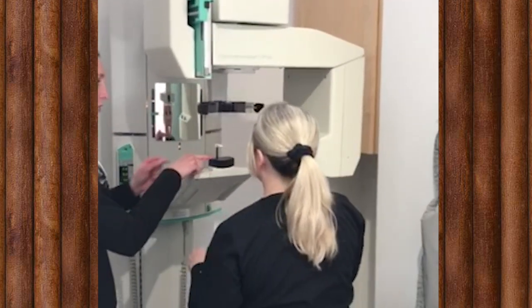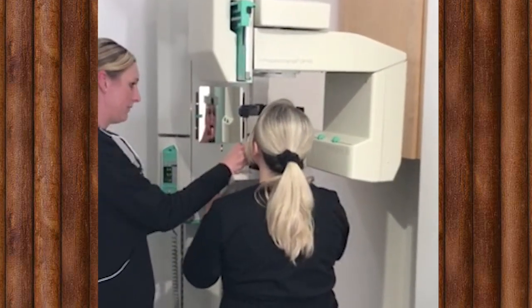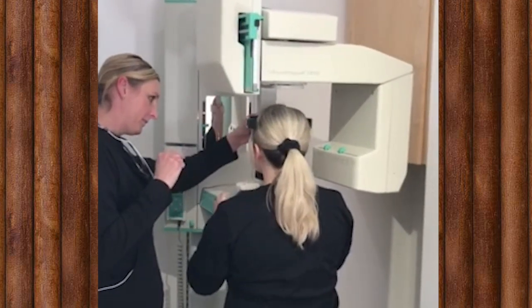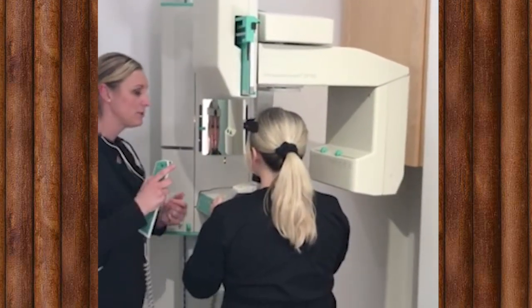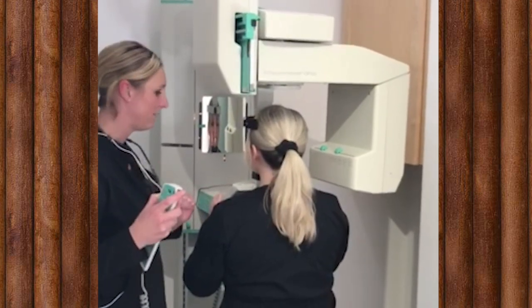You're going to rest your chin right here and bite on this stick. I want you to put your tongue to the roof of your mouth like you're sucking on a straw. Push your lips together and be very still.